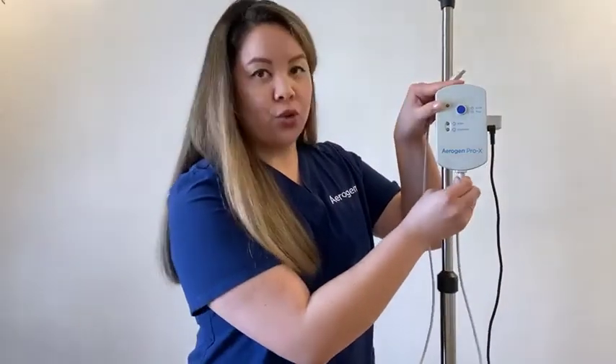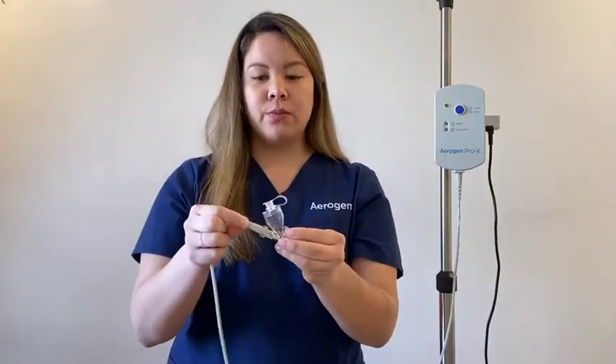This is the Aerogen controller cable. Plug the Aerogen controller cable into the base of the Pro-X controller. Firmly attach the other end to the Aerogen Solo. Open the plug on the Aerogen Solo. Using a pre-filled ampoule or syringe, add medication to the Solo. Close the plug.